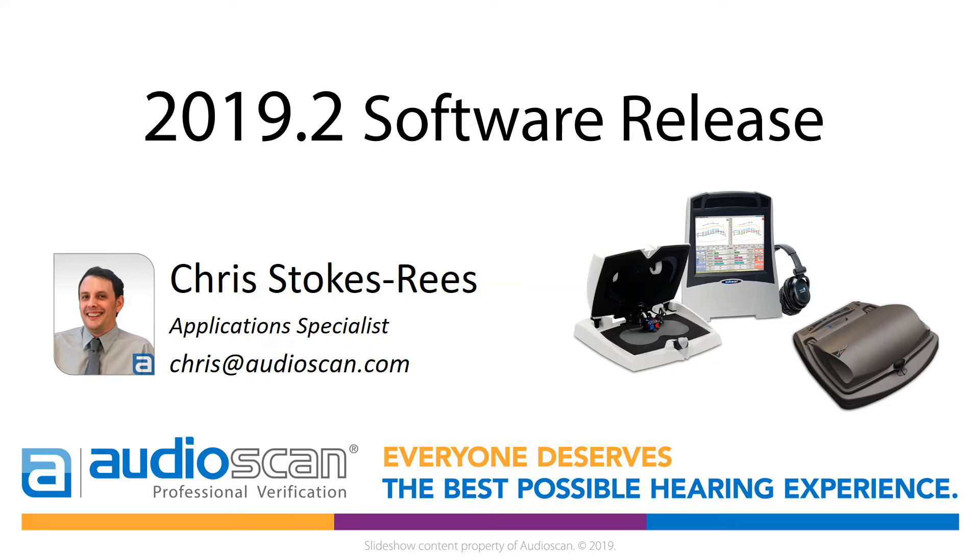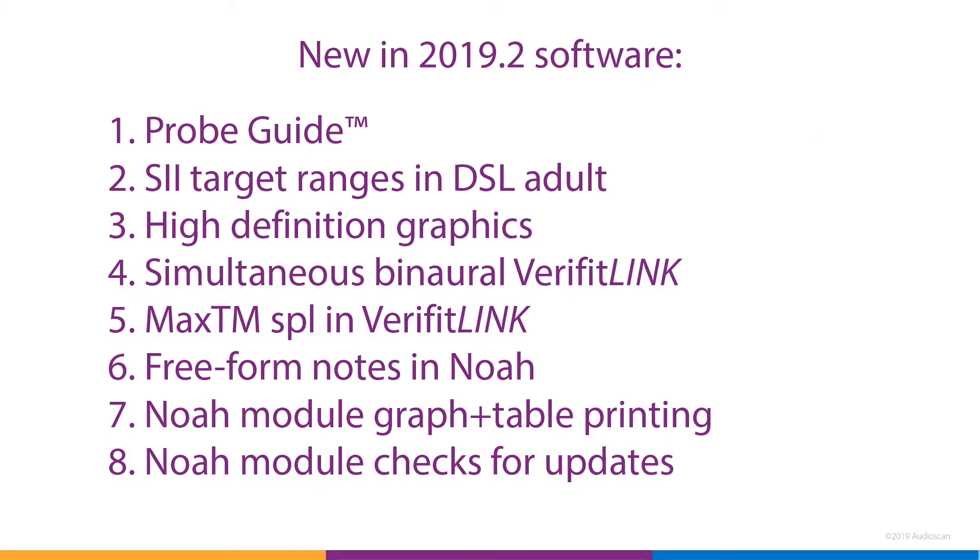This video will give you a quick overview of the 2019.2 software release for AudioScan Verifit2 and Axiom Verification Systems. We'll look at each new feature briefly. Please consult our user guide or the context-sensitive help available in your AudioScan product for complete instructions for use.